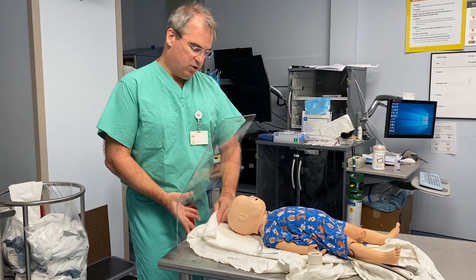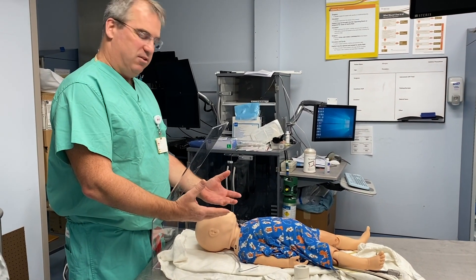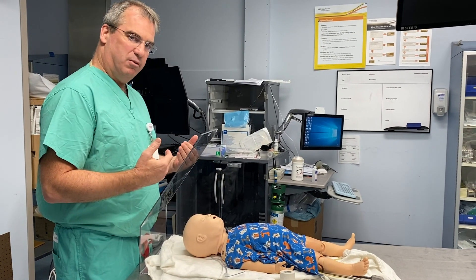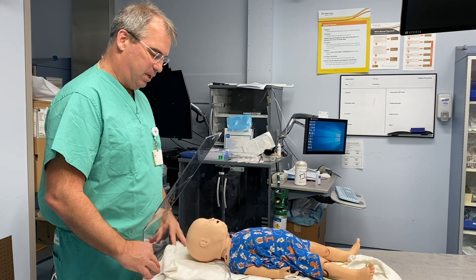We demonstrated for the adult — this would be in the pediatric patient as well. The provider has their hands but is protected from any droplet aerosols and can easily do direct laryngoscopy or video laryngoscopy.